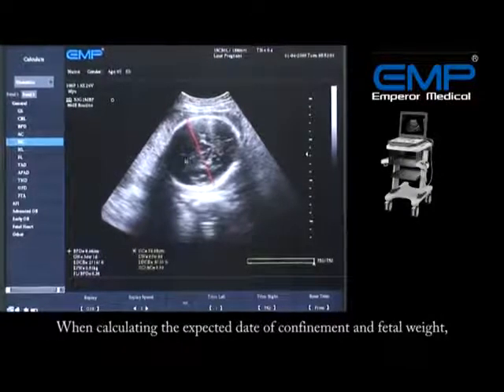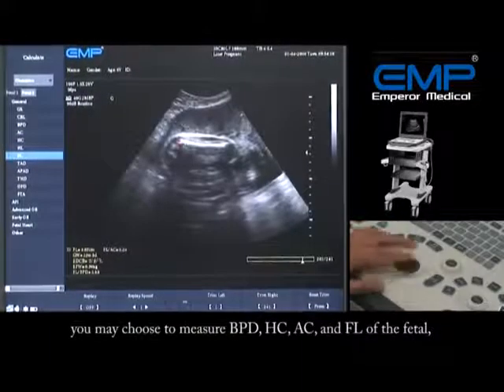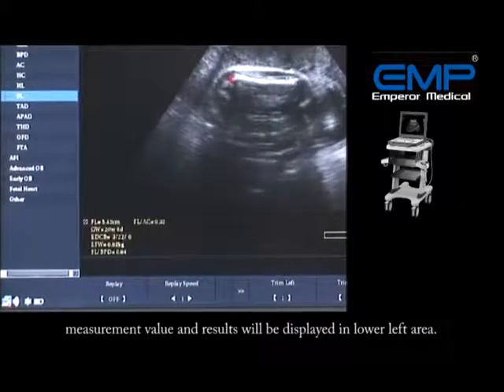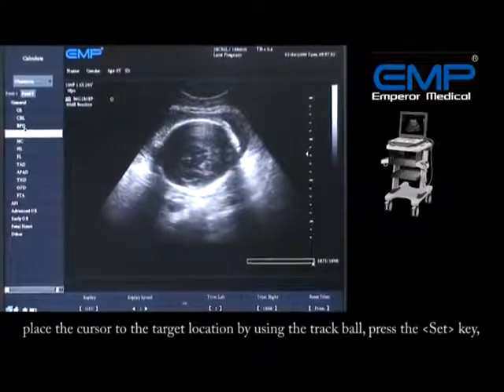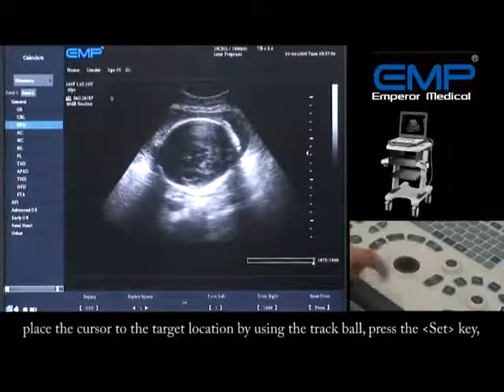When calculating the expected date of confinement and fetal weight, you may choose to measure BPD, HC, AC, and FL of the fetus. Measurement values and results will be displayed in the lower left area. To measure the BPD, place the cursor at the target location using the trackball, then press the Set key.